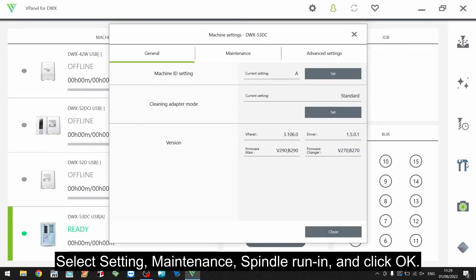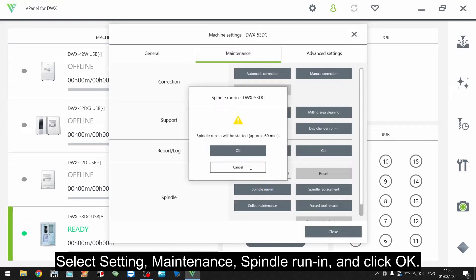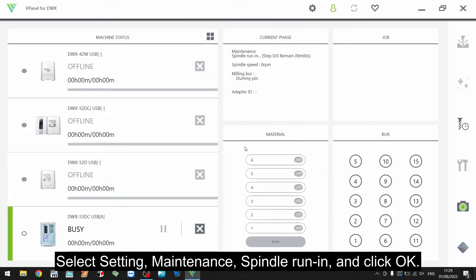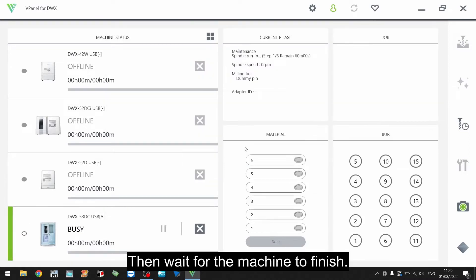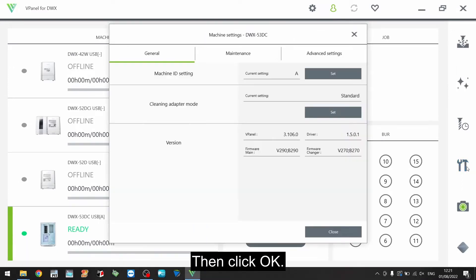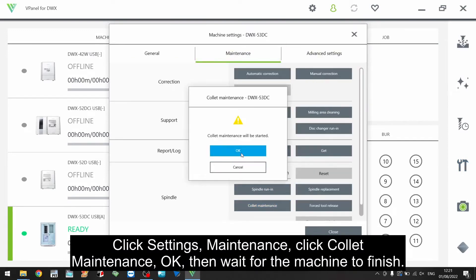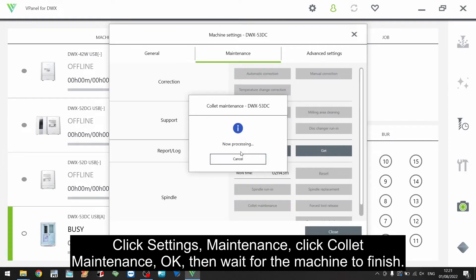Click Settings, Maintenance, then Spindle Run-In. Click OK and wait for the machine to finish, then click OK. Click Settings, Maintenance, then Collet Maintenance and OK. Wait for the machine to finish.